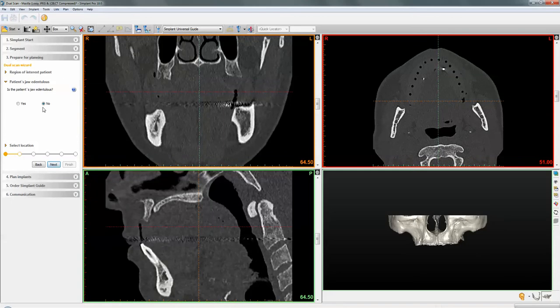The wizard will ask: 'Is the patient completely dentureless?' Select Yes and then move forward.